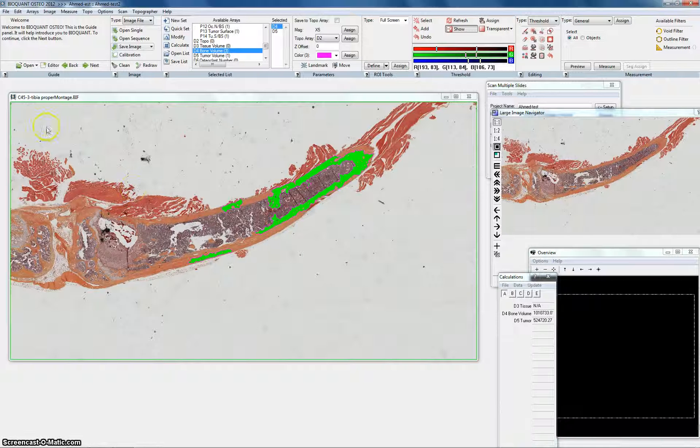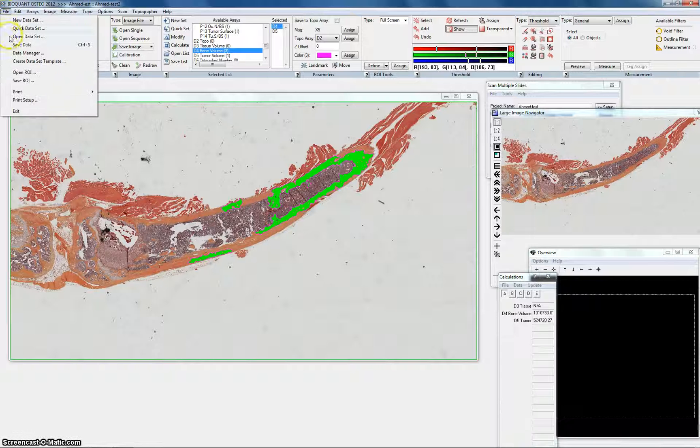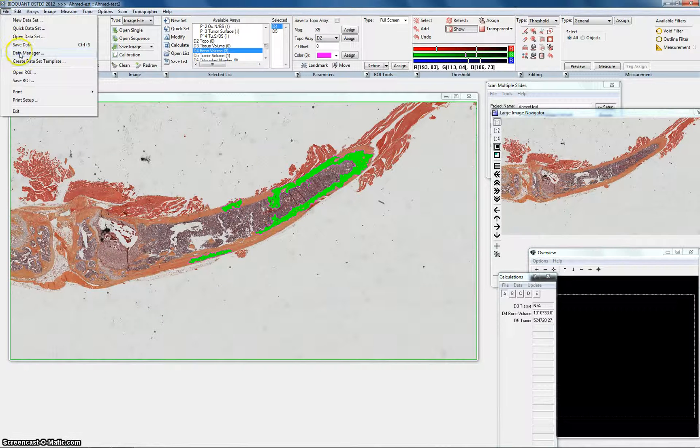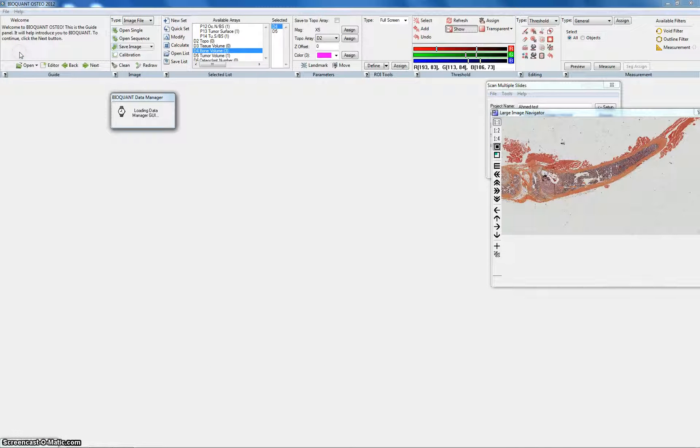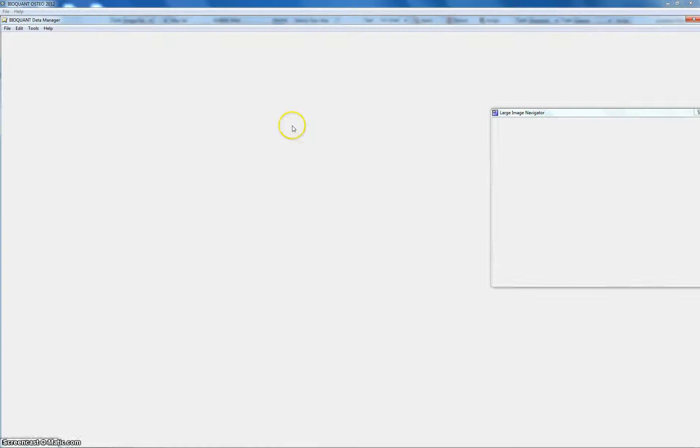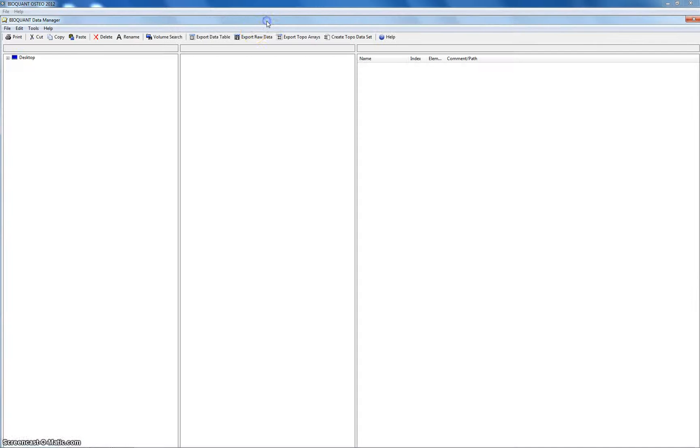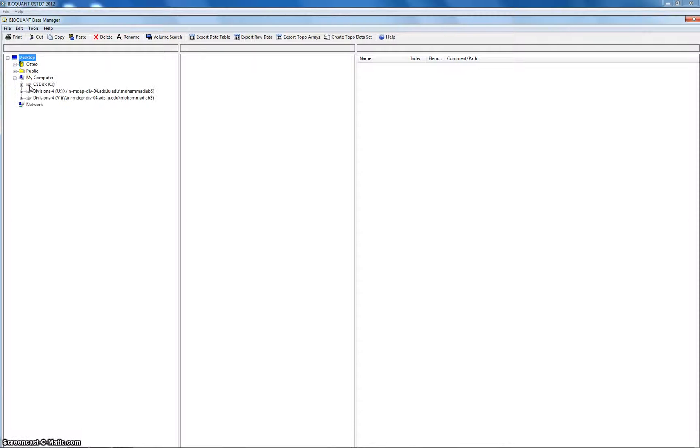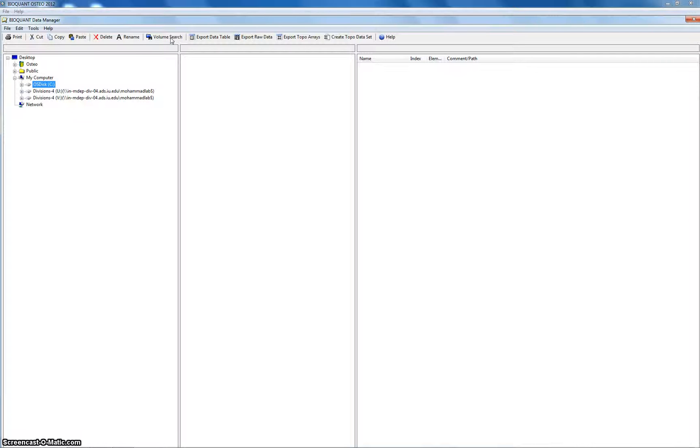So you want to go to file and then data manager where it stores the data. It will give you the box. Usually it takes some time. Please don't rush it because everything's going to freeze. This is the data manager. You make the search location the C drive. And then you hit volume search. Once you hit it, it's going to take a while. Maybe five minutes more or less. Maybe one minute. Maybe less. So I'll pause that video. And please, again, don't rush it.